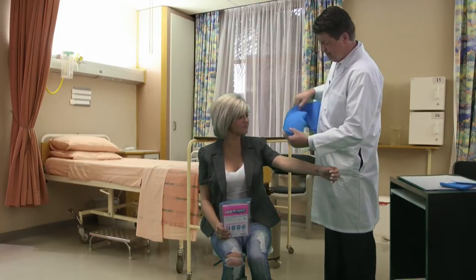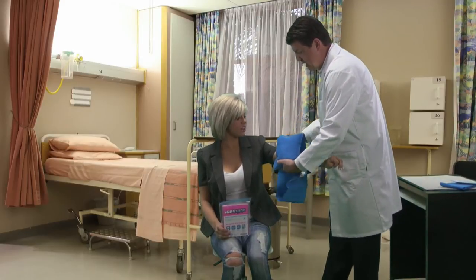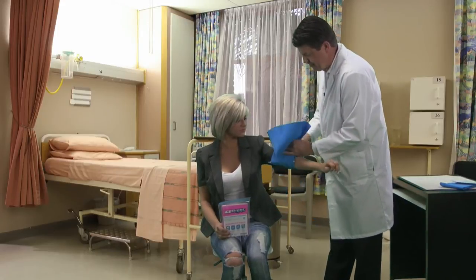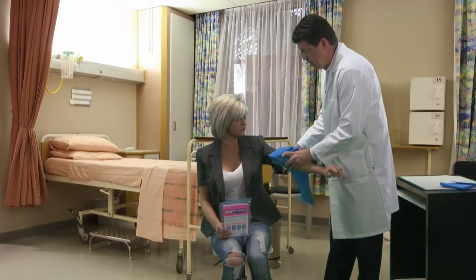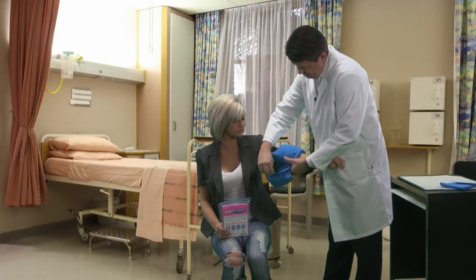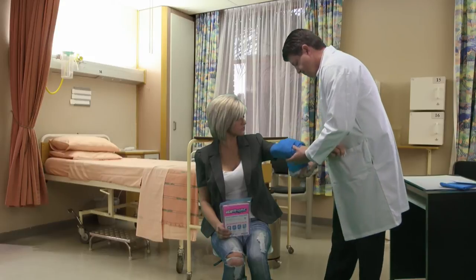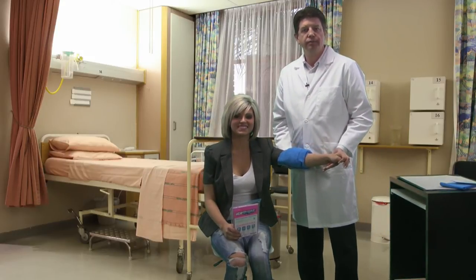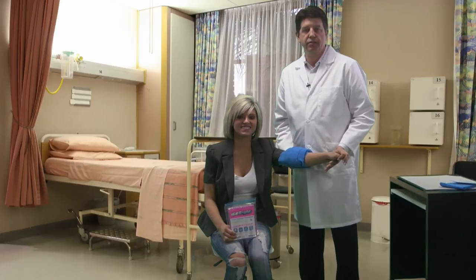It can then be applied where the patient needs ice and compression. It is latex free and MRI compatible as well as x-ray compatible. That is the Avcor Latex Free Ice-Rite.